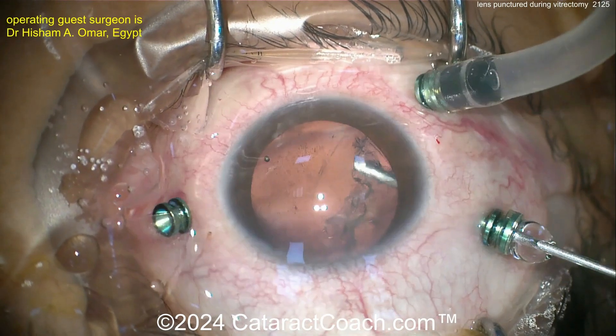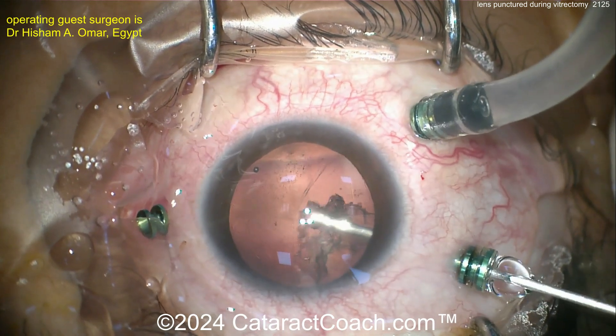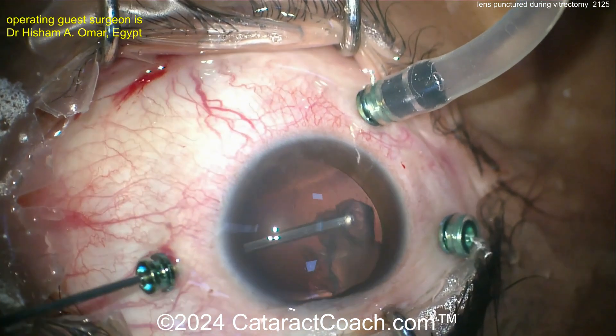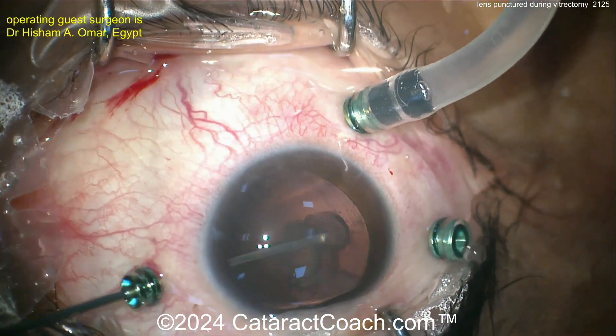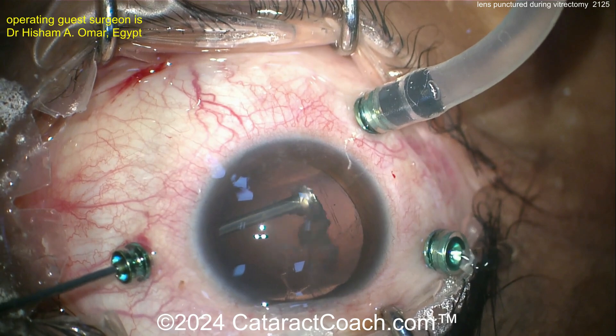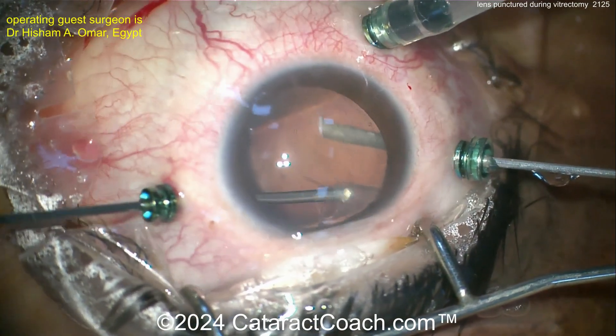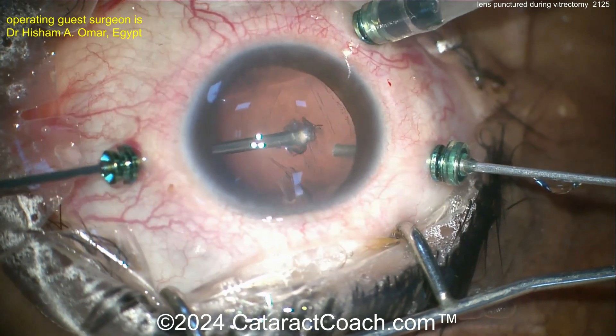You can get an anterior capsulotomy — or a capsule rhexis if you try — but I think just using the vitrectomy cutter would be great, because that provides very good strong support. That would be a better option than doing something like a Yamane technique. Removing that lens material here in its entirety.